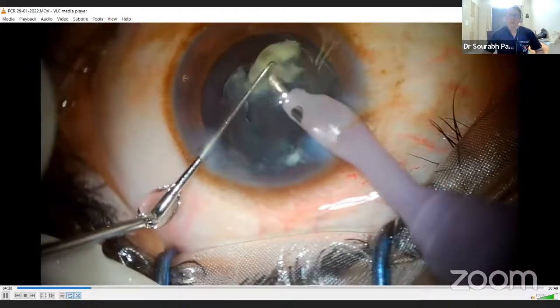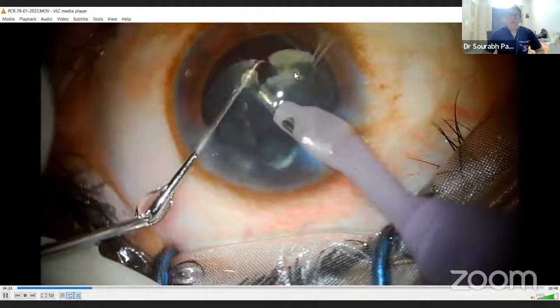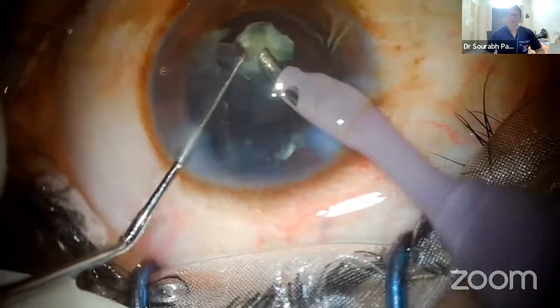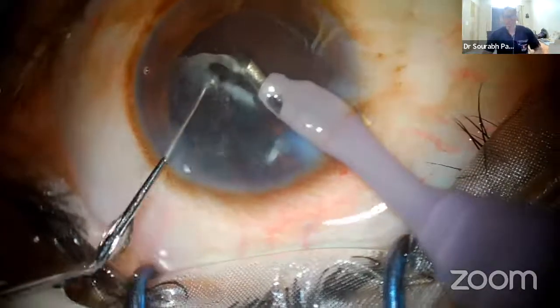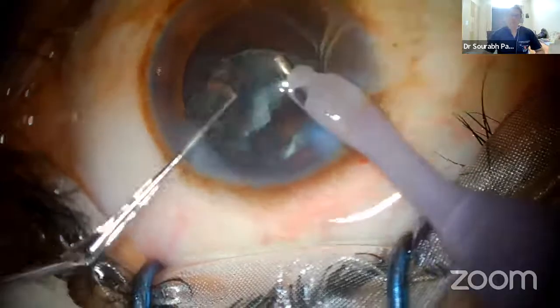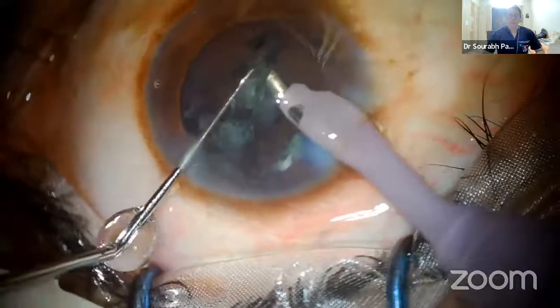Till that time, he didn't have any visual problem, but definitely it looks like a posterior polar kind of cataract. For thorn prick, I couldn't see any corneal injury or opacity as such. So more likely a congenital phenomenon.